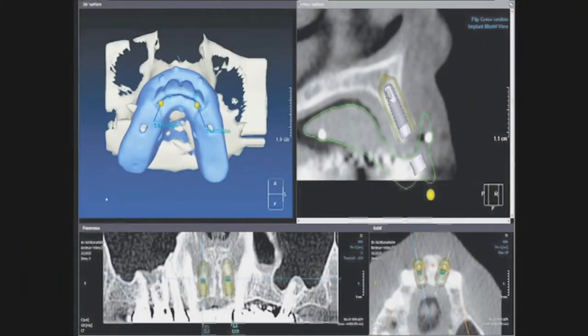In the cases described here today, the CT scan is done with the patient's teeth open at least 5 millimeters. A cotton roll or a stack of tongue depressors can be used. You don't want the patient to be scanned in a fully occluded state or clenched, as this could create overlap and inaccuracies of the temporary prosthesis.